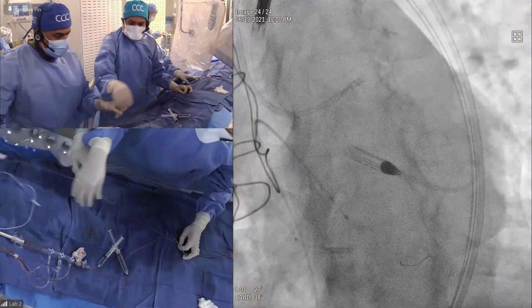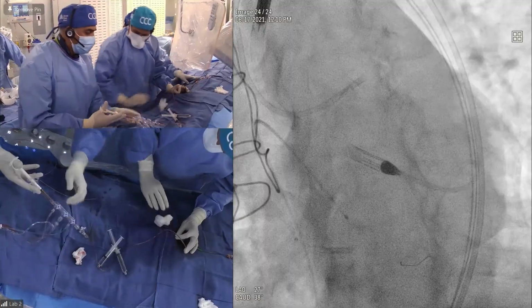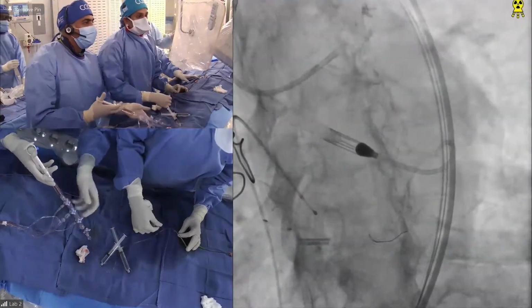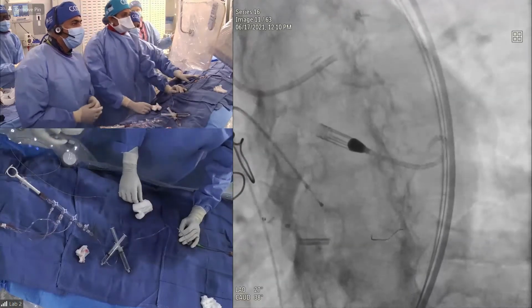Okay. I've got to say that I don't really like the 1.25 burr. If you take a look at the angle, it's a very shallow angle. And the 1.5 has a steeper angle. It actually cuts better. I think the 1.25 doesn't really cut very well. Now I use 1.5. I hardly ever use 1.25 now.